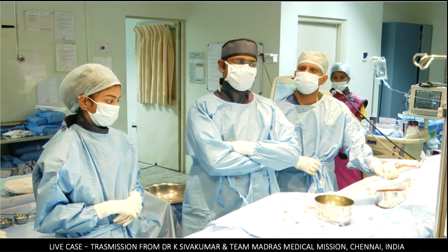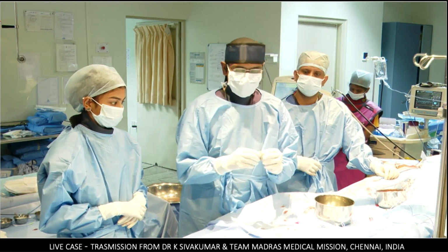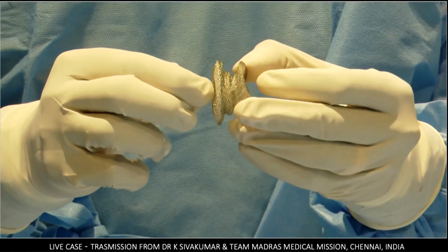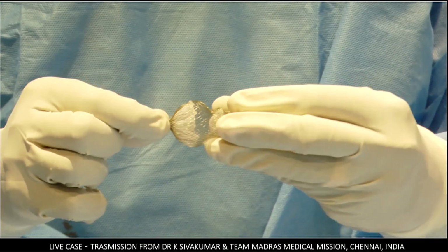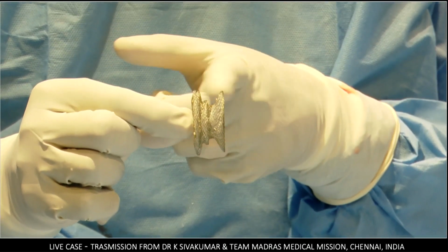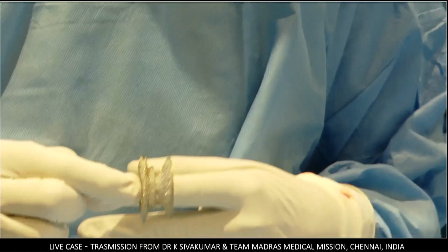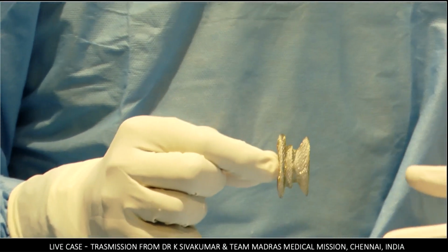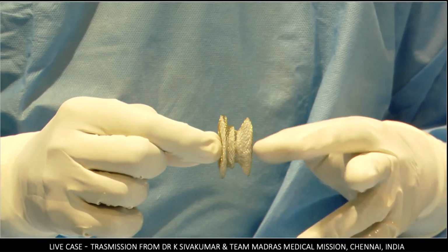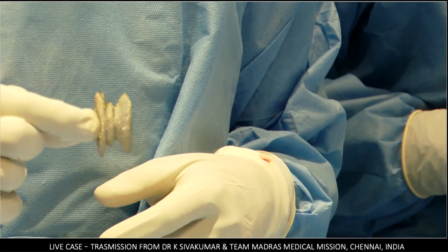Possible, Shak. Actually, the thing is, I am not precisely able to understand also. The reason being, the waist is arranged in such a way that the right atrial part is having the largest waist. I'm now holding the right atrial part. I'll make it a little concave so that it loses its memory. The right atrial part has got the largest size and the left atrial part has got the smallest size. I feel that probably the device will get remodeled into the heart irrespective of whatever be the size of the device. And I think this differential waist is not going to be clinically relevant.